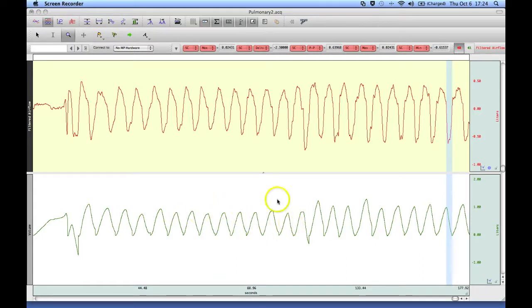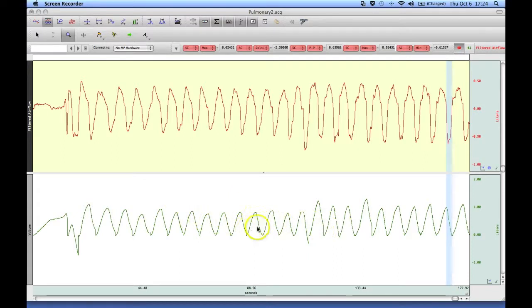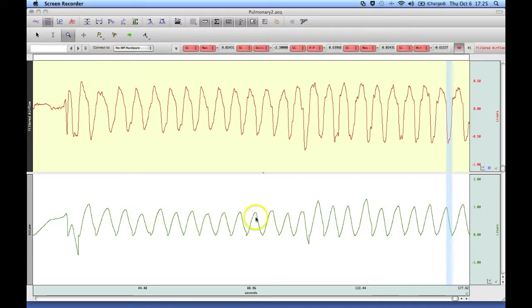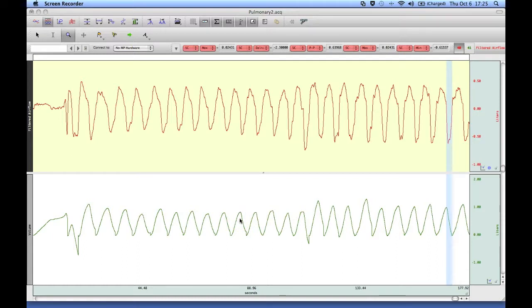Now the analysis routine that I'm going to demonstrate will allow you to calculate this, but more typically people will calculate the volume signal while they're recording their data. And this can be done as an online calculation channel or after the recording as an offline transformation.